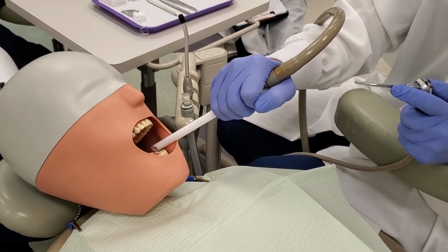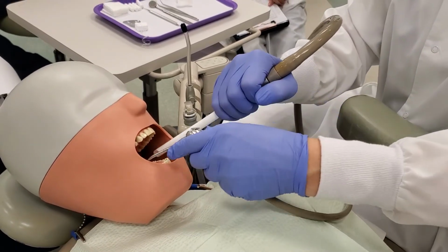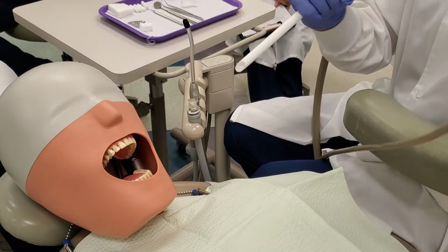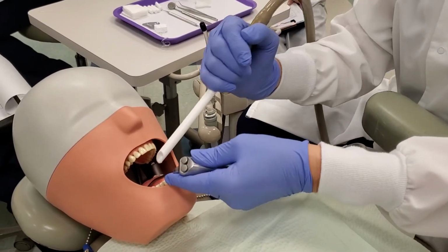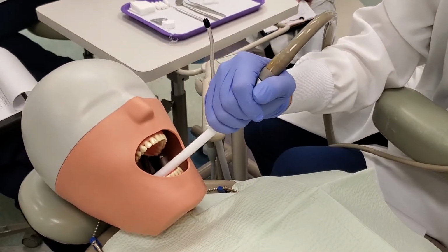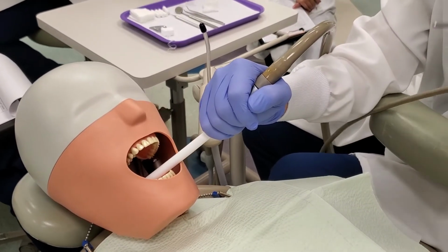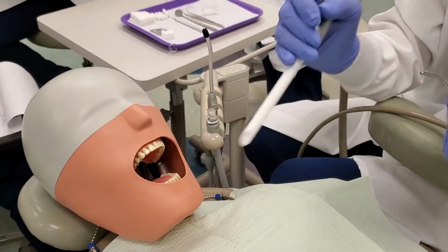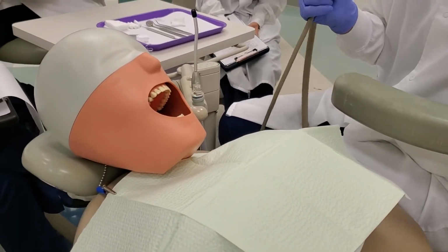Place the HVE to clear the mandibular right area. This is the one that most students struggle with because of the tongue. So again, use the air water tip. You're going to retract the tongue before you place that HVE. And again, you're going to place it parallel to the tooth, with the pointed edge back, and it's not on the tissue. Okay? So now I'm going to go ahead for number 4, air water syringe.